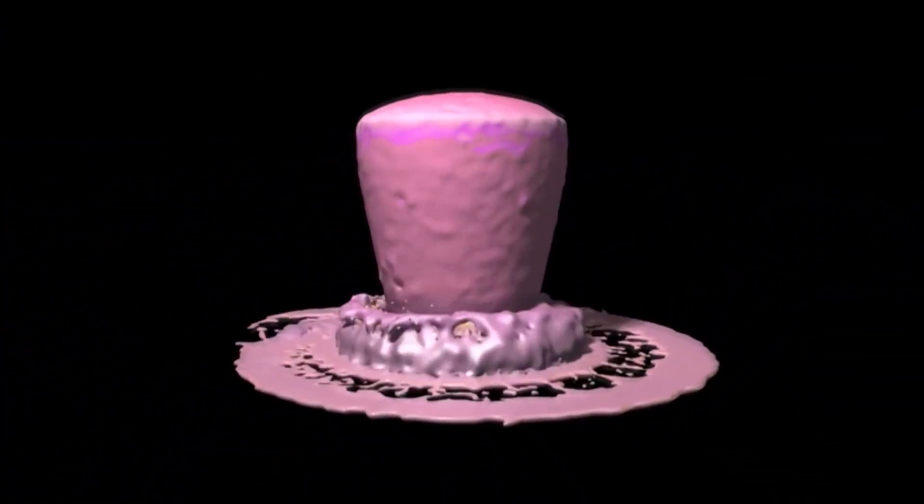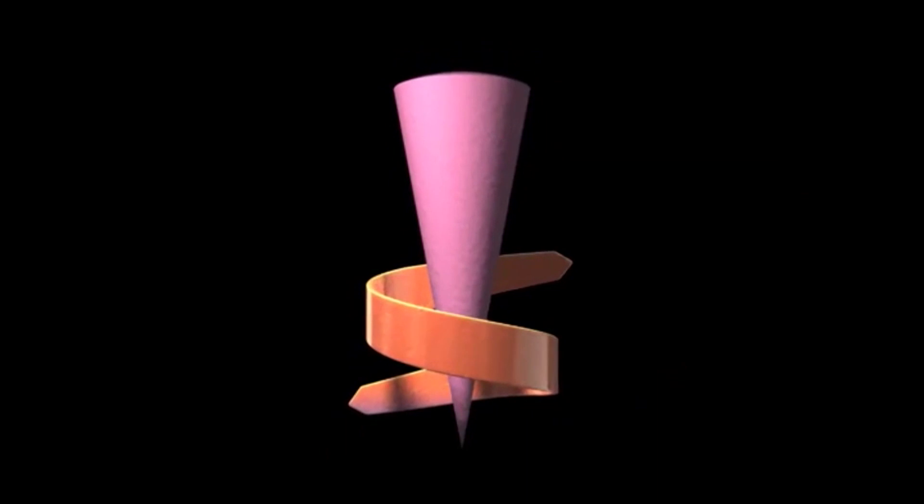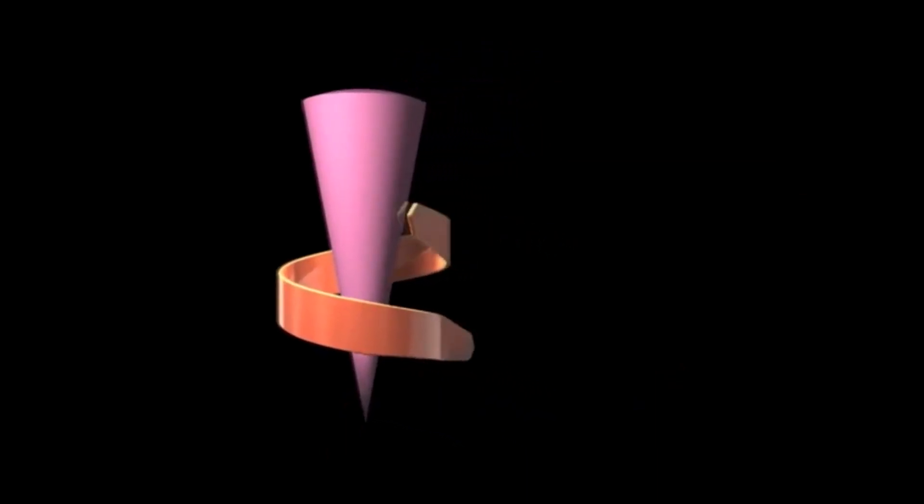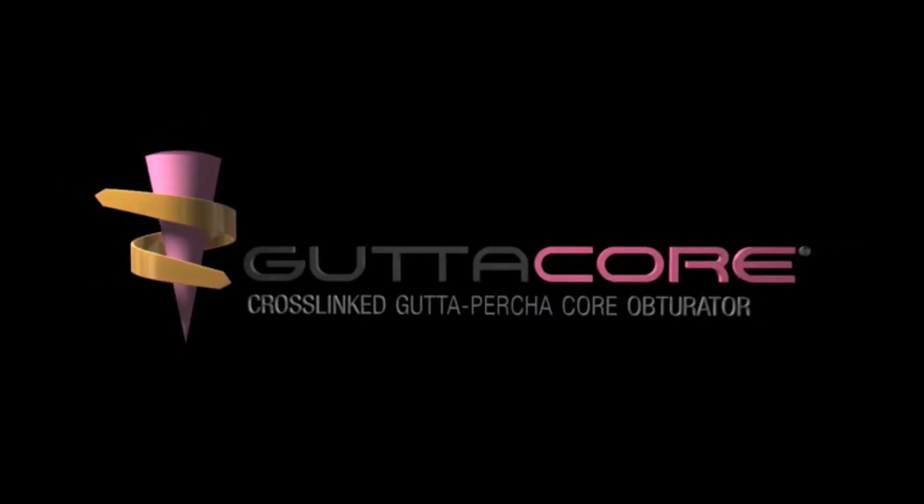What if there was a way to turn warm, flowable Gutta-percha into an easy-to-remove obturator core? Cross-linking technology makes it possible. Introducing GuttaCore Cross-Linked Gutta-percha Core Obturators, because it's what's inside that counts.